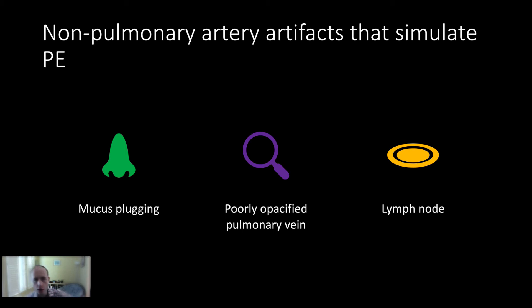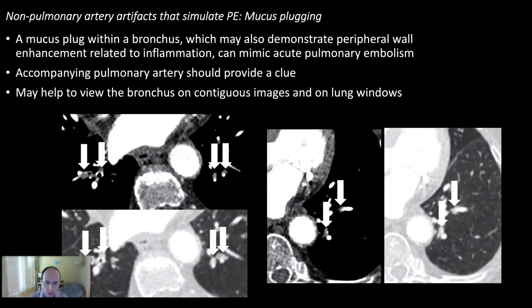Now shifting to things that are not pulmonary artery filling defects but may simulate or be confused with pulmonary emboli. With mucus plugging, bronchi are right next to their accompanying pulmonary arteries. If you're not paying close attention, or if motion artifact obscures what is pulmonary artery versus bronchus, you could mistake these for pulmonary artery defects. It's important to look for the adjacent bronchus and pulmonary artery, and trace the apparent filling defect back to the pulmonary artery — that's the key.